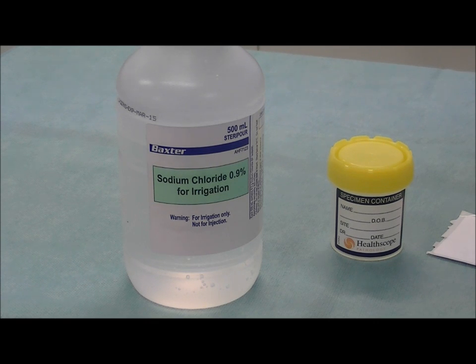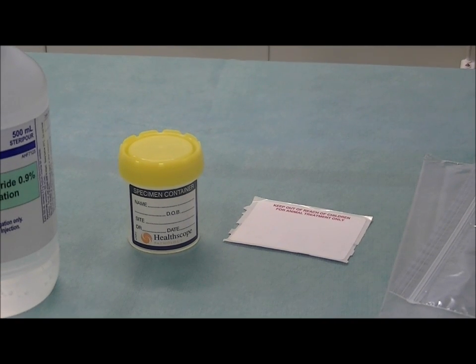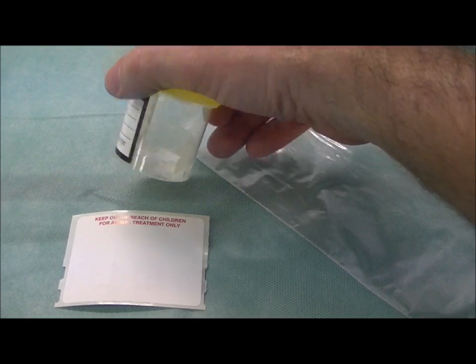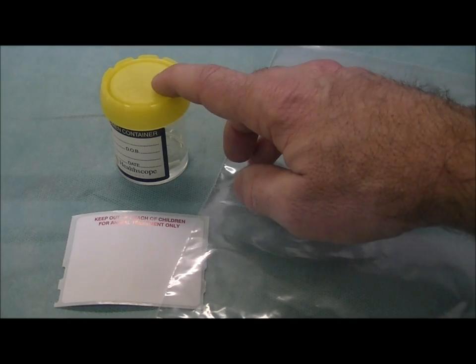The second type of sample that can be used are fresh tissue samples. These can be collected from a live snake via surgical biopsy conducted by a veterinarian, or alternatively collected at the time of a post-mortem on a dead snake. You will need the tissue samples — only small samples, pinhead size is more than adequate — and in order of preference you should collect brain, kidney, lung and liver. You will also need about five mils of sterile saline, a sterile container, a self-adhesive label, and a Ziploc bag. Simply put your tissue samples into the container with a small amount of sterile saline, label it with the snake's name and your surname, and place it into the Ziploc bag and seal that.